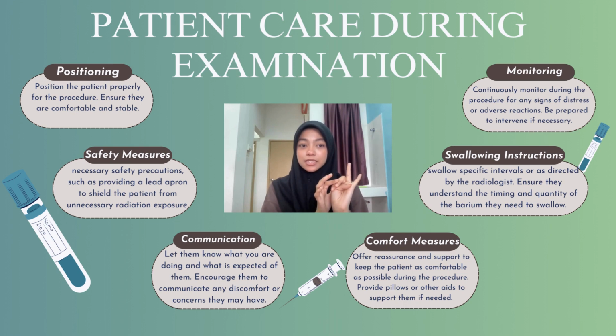Safety measure: take necessary safety precautions, such as providing a lead apron to shield the patient from unnecessary radiation exposure. Communication: let them know what you are doing and what is expected of them. Encourage them to communicate any discomfort or concern they may have. Lastly would be comfort measure: offer reassurance and support to keep the patient as comfortable as possible during the procedure. Provide pillows or any other aids to support them if needed.